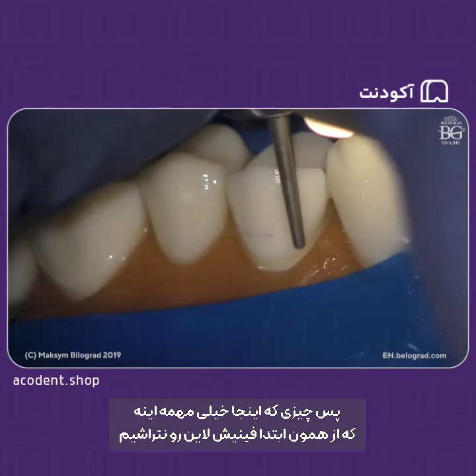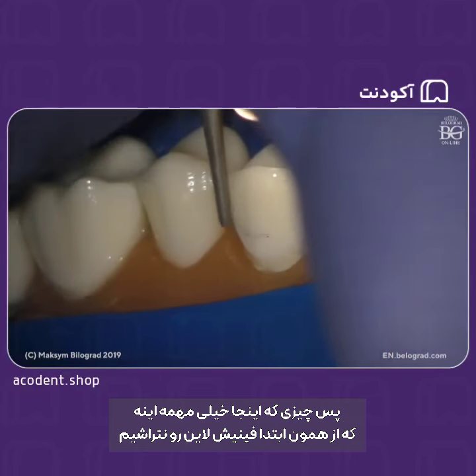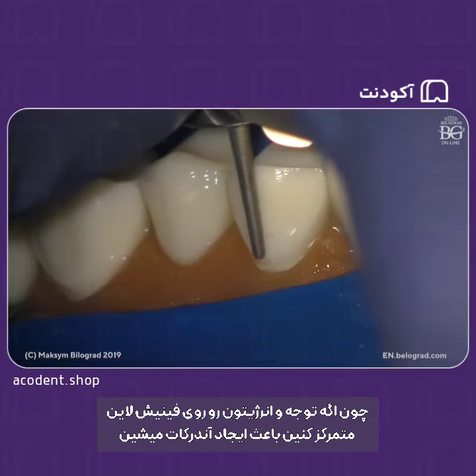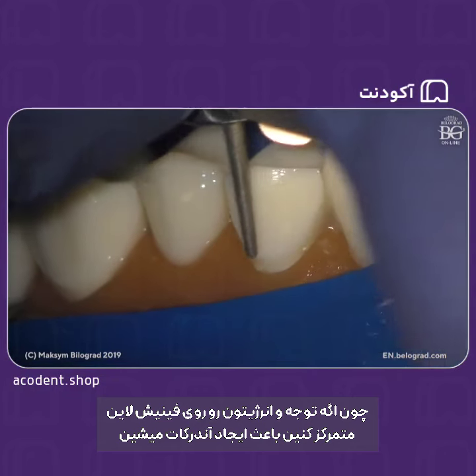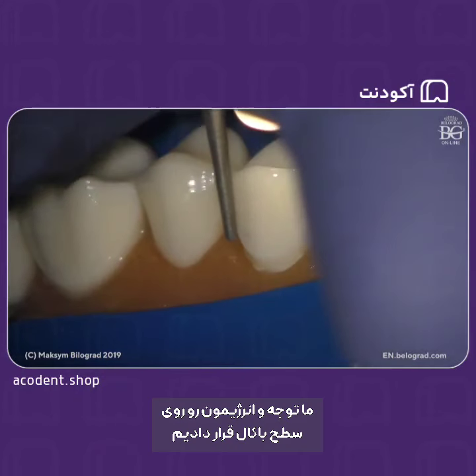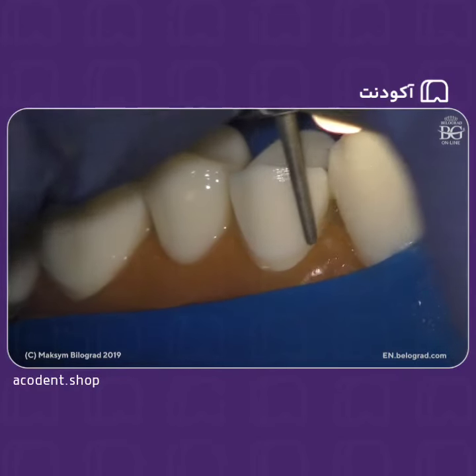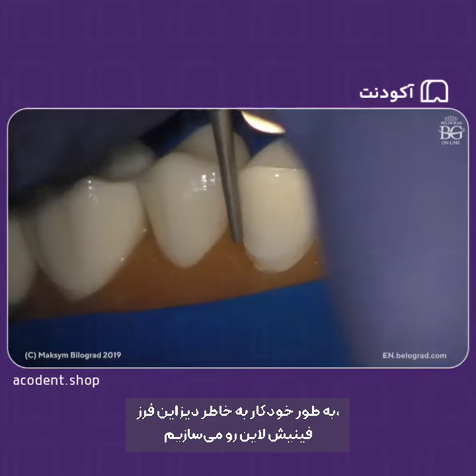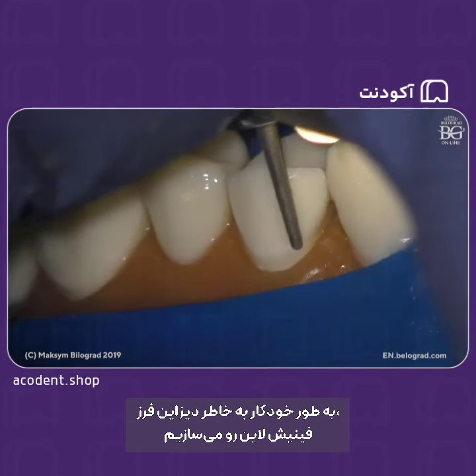So what is really important during this step is not to make the finish line at the very beginning, because if you concentrate your energy and your attention on the finish line, you will make an undercut. But we have to concentrate our energy and attention on prepping the bulbosity, to remove this mark, and you will get the finish line automatically because of the design of the burr.